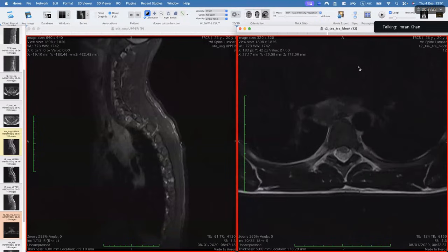One last question on this case because I want to show you more cases. Any other cause that you can think of besides metastatic disease in a 20-year-old chap with multifocal bone disease? This could be due to metabolic bone disease, if the patient has any history of metabolic causes like hyperparathyroidism. Okay, we'll come back to this on the feedback. Don't worry about it.